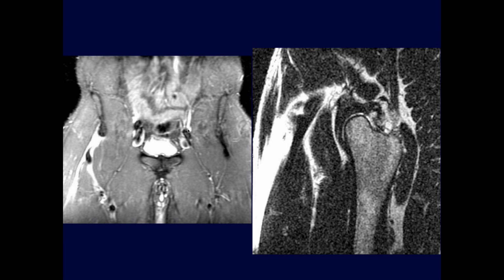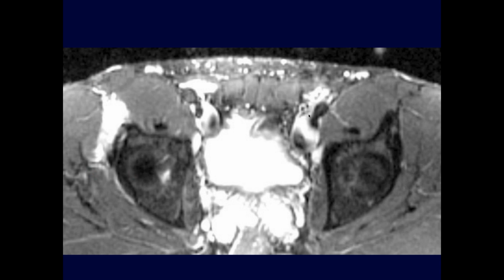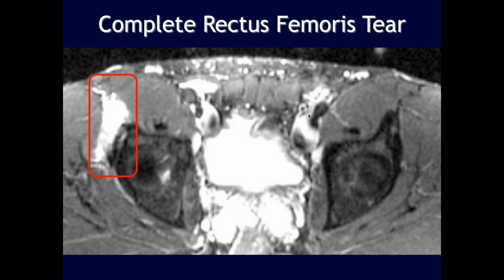Okay, so on the coronal, either STIR or PD image, we have a lot of fluid in a similar region to the previous exam. It looks like it's coming off the anterior iliac. I'm wondering if that black is actually cortex, like an avulsion, or if that's tendon. It's tendon. If that's tendon, it's completely torn and distally retracted. So full thickness tear of the rectus, both the direct and the reflected head, both distally retracted. That's fixable, and I would fix it.